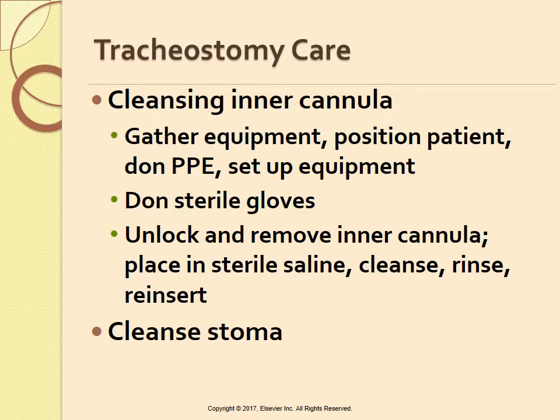Clean technique rather than sterile technique is used at home. Step number 3, position the patient in semi-Fowler's position. Step number 4, assemble needed materials on bedside table next to the patient. Step number 5, wash your hands, put on goggles, and clean gloves.